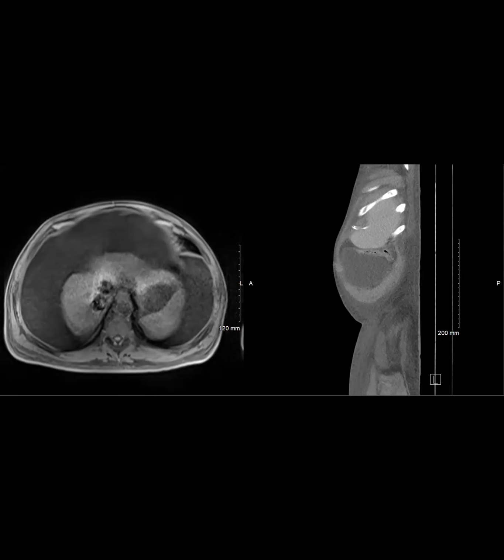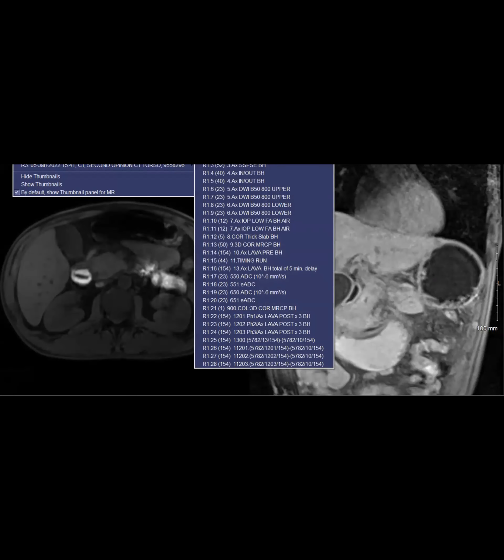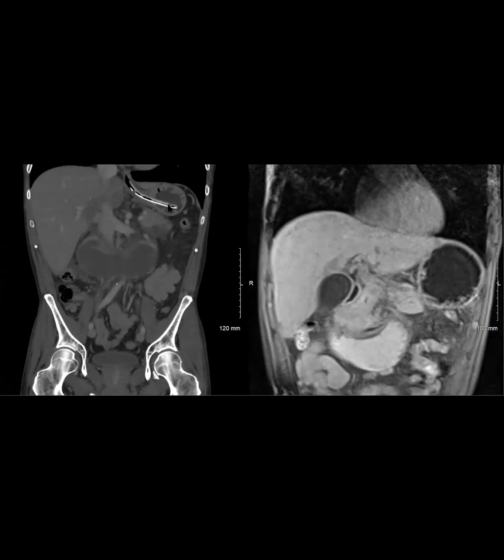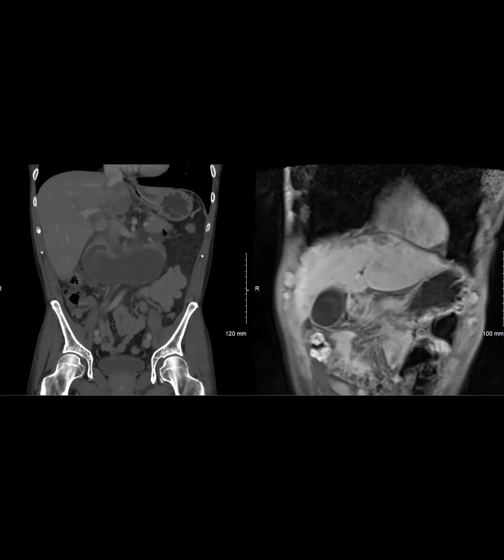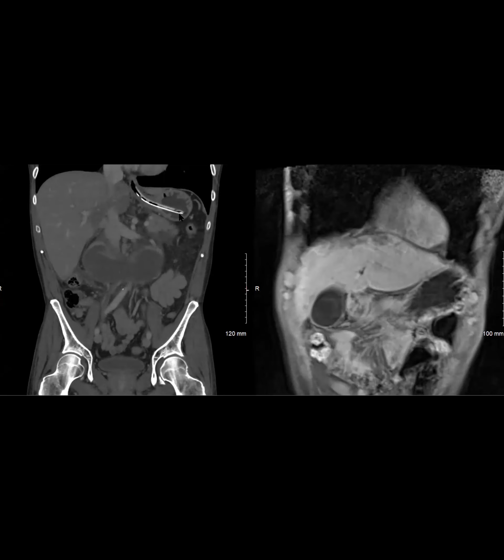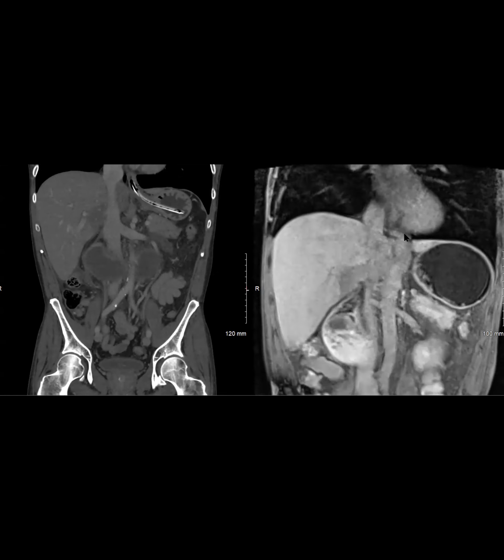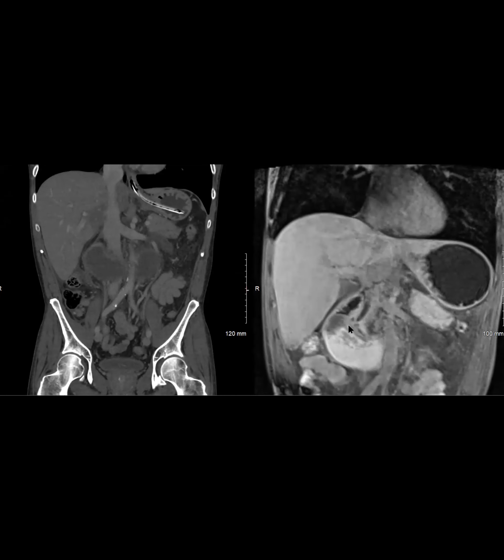Let's see. Did he have any treatment, or did they just let it resolve on its own? The indication was just history of... He did have an NG tube right after this MR. No, it's a great point, but I don't know at what point they removed the NG tube. After this MR, it looks like they did put an NG tube, and you can see that at the time of the MR there was relative distension of the stomach. And it's a great point that this would cause gastric outlet obstruction.